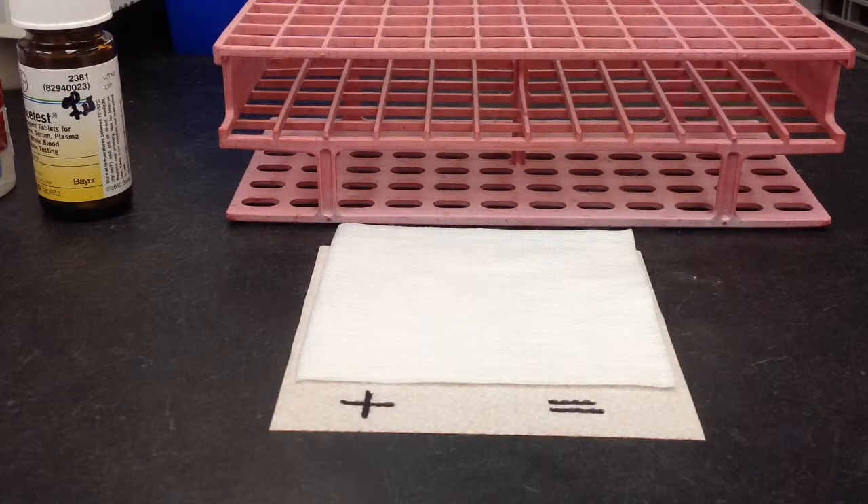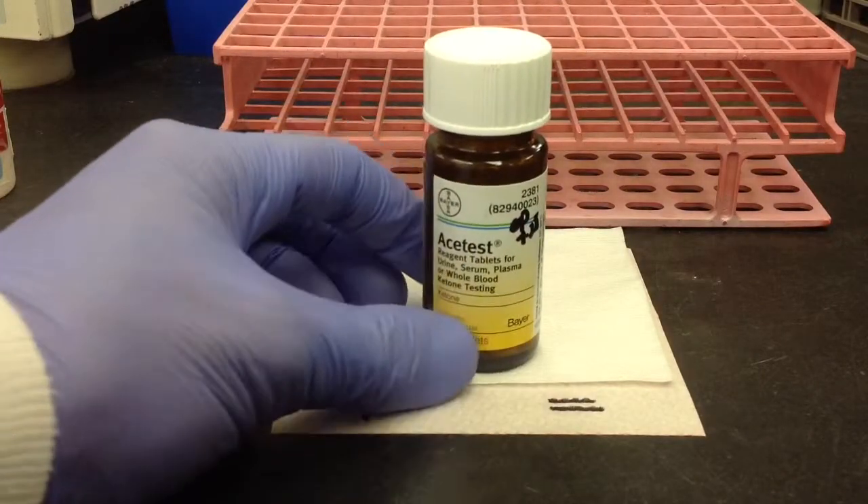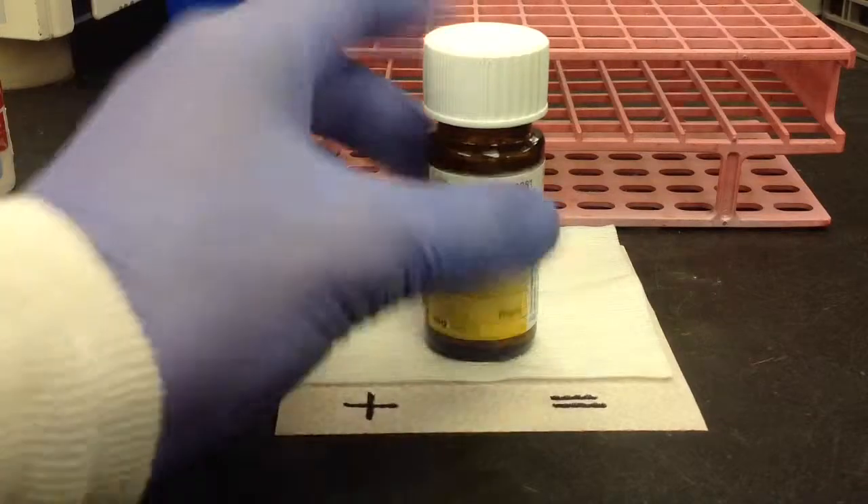In this video, I'm going to show you how to perform an ACE test for the detection of ketones. This can be done for urine, serum, plasma, or whole blood.